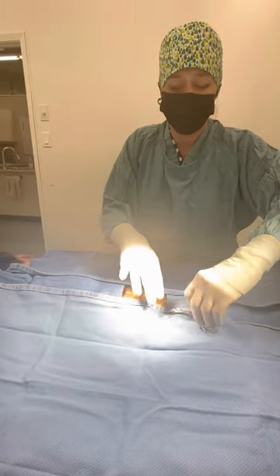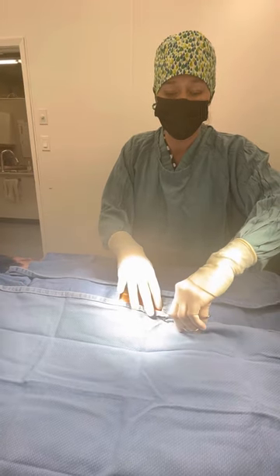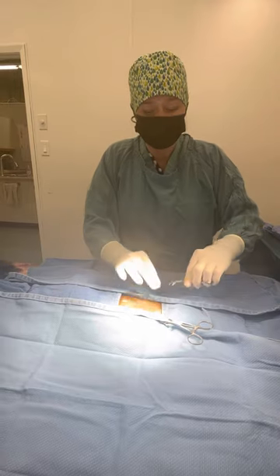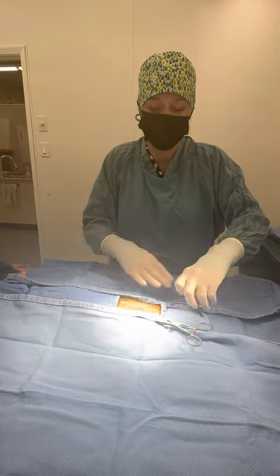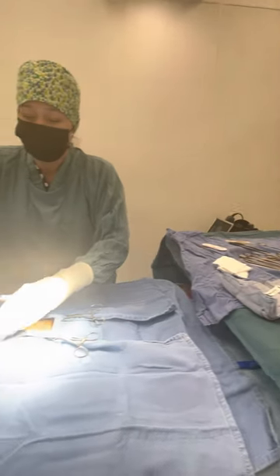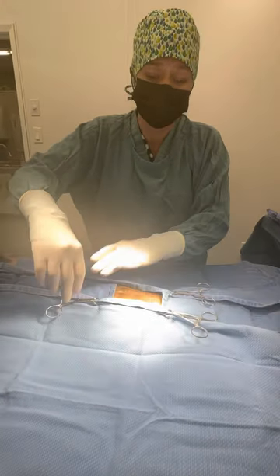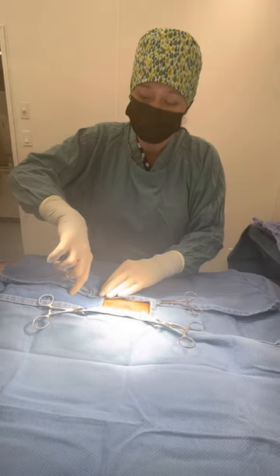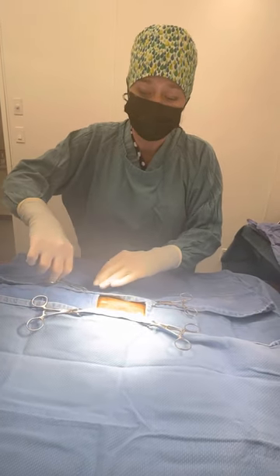In order to keep these huck towels where they are — they've all been autoclaved — I just use some clamps to make sure that we maintain this surgical area that is nice and sterile. Prior to this, her coat on her abdomen was clipped and then prepped for surgery to make sure that there's no hair.